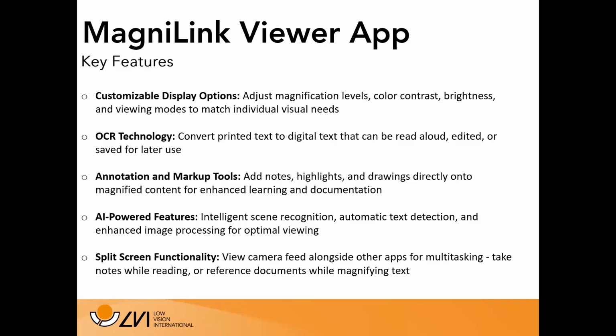So the same student that likes her Wicked pink and green, she uses this tool to complete her Algebra 1 worksheets. So she'll put her worksheet under the camera, use that Notepad tool, capture the image, and then she can pinch and zoom, zero in on a particular problem, use her Apple Pencil to solve that problem, pinch and zoom back down and go to the next problem, and so on. She can then save that worksheet and send it to her teacher. So that's a really great feature within our software.